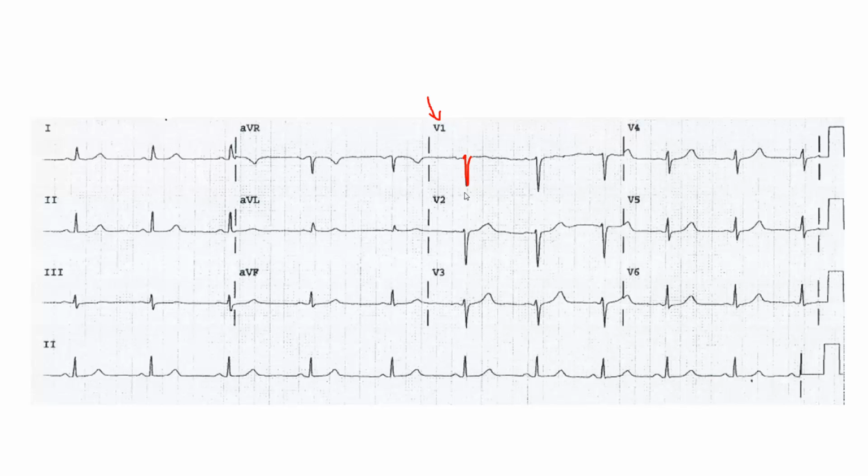Now, if we go to V2, we again see a tiny divot and a big spike downwards. But our tiny divot, the R wave again, is a little bit bigger than it was in V1. And if we go to V3, we see the same pattern again, but here the R wave is a little bit bigger than it was in V2. And so if we keep walking along this set of precordial leads, we see that in V4 the R wave is a little bigger, V5 it's gotten substantially bigger, and then finally in V6 it's the most positive deflection we've seen yet.